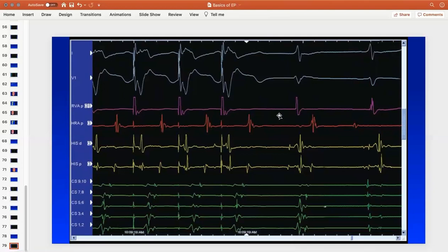I have a question. Yes, Toba. The fourth HRA, the fourth beat. This one. Yes, exactly. It's a retrograde activated A wave, right? Yes. Does it have to be conducted again antegrade, or is this the end? Like the previous three, or retrograde? Yes. I think the cycle should stop. Why did it stop? Like the previous three as well.